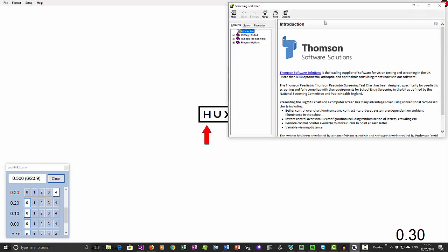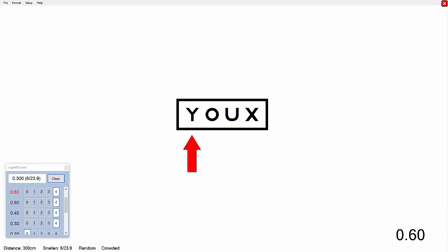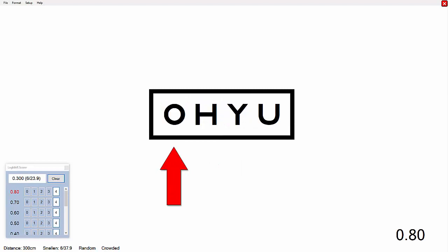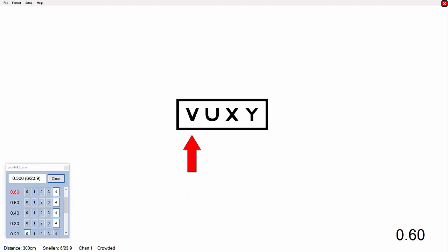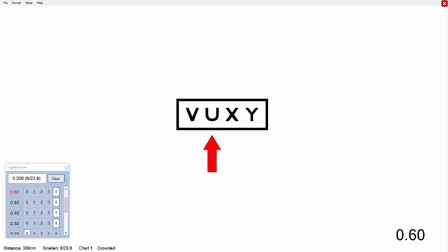So, to measure visual acuity, the child is positioned at the predetermined distance from the screen, usually 3 meters, and one eye is covered. The letter size is set to a size that the child can read quite easily to ensure that they understand the task. Letter size is varied using the up-down cursor control keys on the keyboard or the remote control. If the child can't name the letters, a matching card should be used. A matching card can be printed out from the resources page of the website.